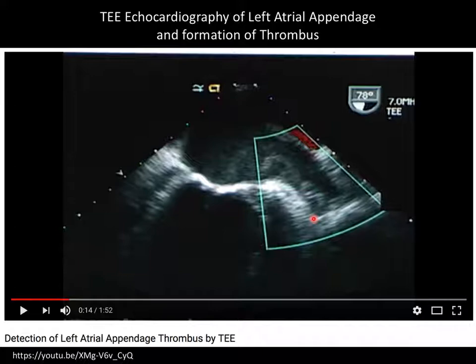And this also is an example of what is the downside of a false negative call. The downside of a false negative call is very high, because you defibrillate a patient who has thrombus, right? So there's high risk with that call. What's the downside of a false positive call? I put the patient on an anticoagulant drug when they didn't need to go on it. That's not terrible. They're going to survive that one, right? And they're probably not going to have a stroke.